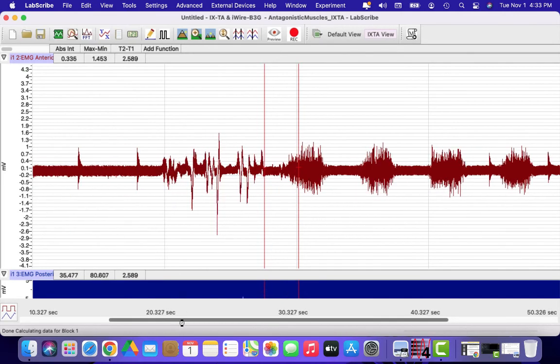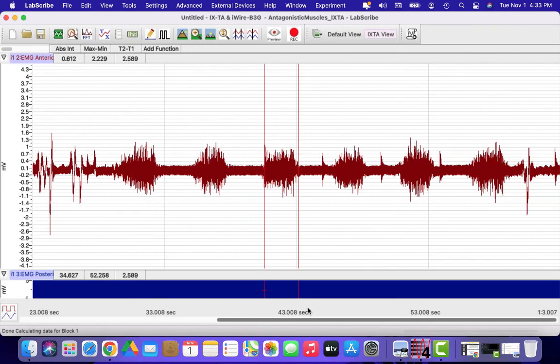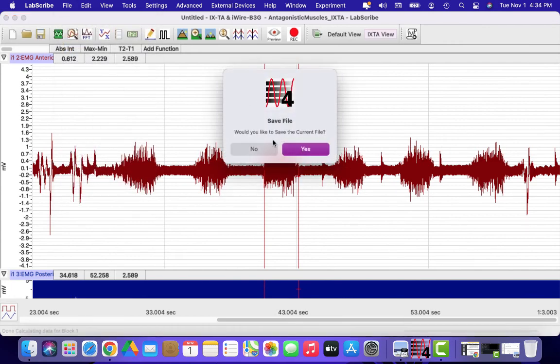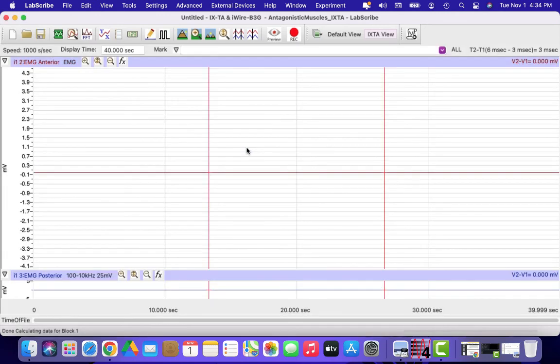You can scroll back and forth through your tracing to find the best burst of activity. When you're finished, go under File, click New, and if you hit No to not save it, it'll give you a clean screen so that you can record a new tracing.